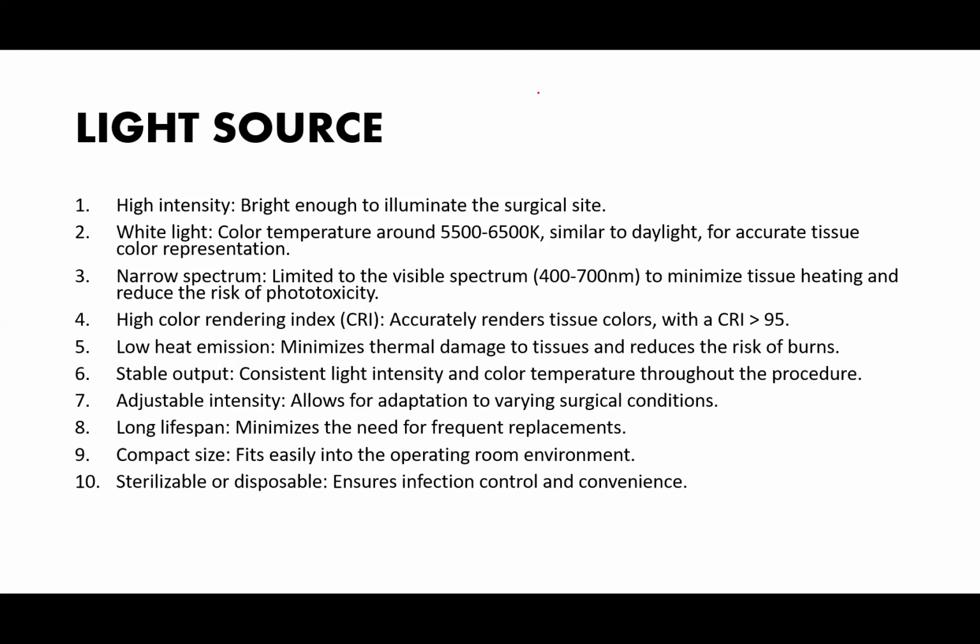Now, it should have a high color rendering index. Okay, you have poor, moderate, and excellent. A color rendering index that is closer to 100 is almost giving you the actual color separation of the target structure you are looking at.